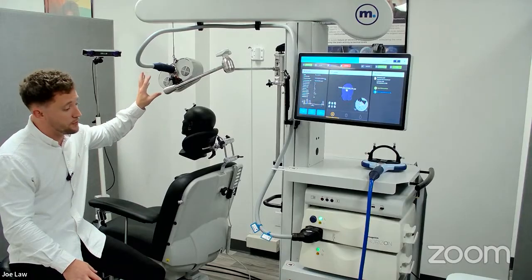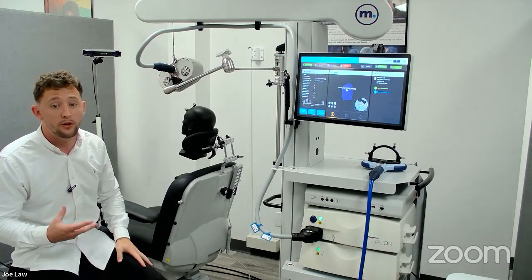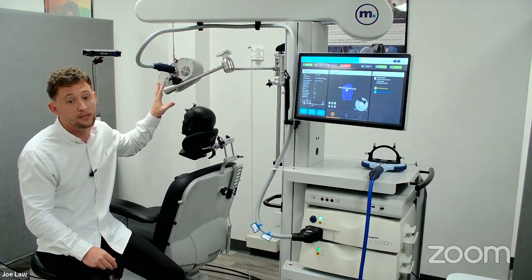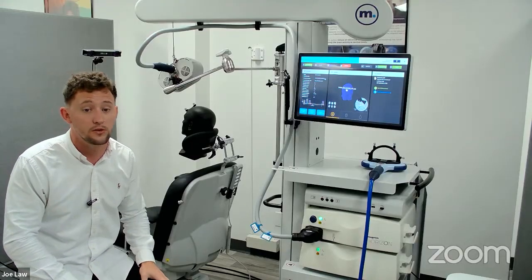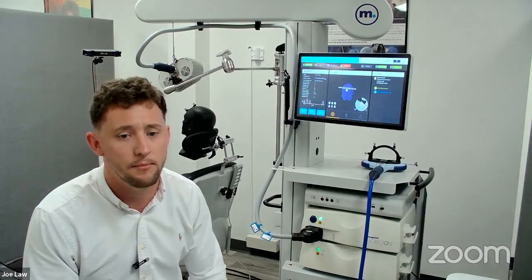If you haven't used your full shot counter and you get to the 5-year limit, we do offer a 2-year extension. The way that works is you send the coil back after 5 years. We will do a full safety test on it to make sure that they're safe. We will then add an additional 2 years to those coils to give you a full lifetime of 7 years on those coils. So very little maintenance on this system.